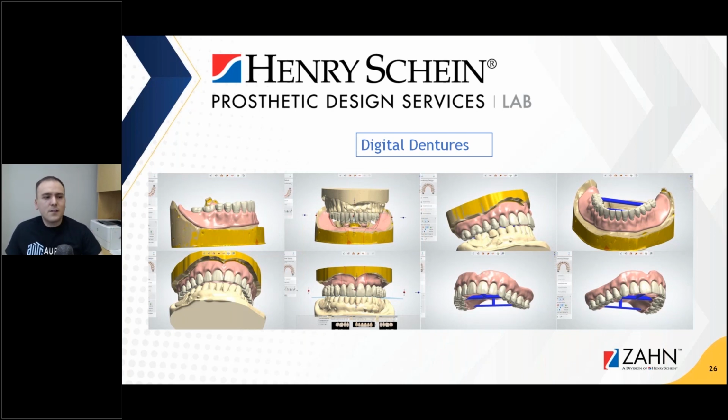But the overall design, the establishing of occlusal plane, the bite rim, the midline, the lateral excursions, and then after that, post-processing them with those blue support bars that you see, so they can actually be printed on a carbon printer, which is the only one approved for Lucitone, is a very specific process, and it works. And those supports really give the material integrity during printing. So those dentures are really important in the market today.